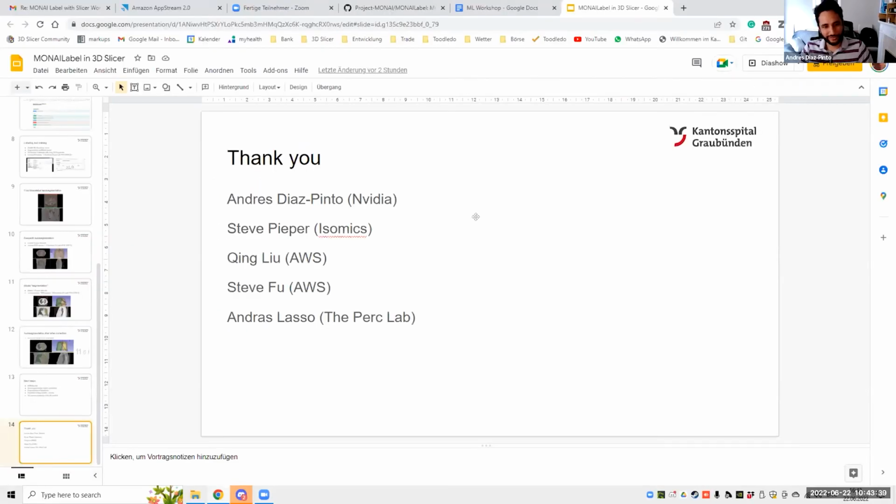Well, thank you very much, Dr. Rudolf. This is very nice. I don't know if there are questions for Dr. Rudolf or comments. I have a couple of things that I want to do. One is how to modify the MONAI Label module, and also go through the different buttons we have in Slicer, and also the frequently asked questions. But I just wanted to check with Steve or Michael. I think that sounds like a good plan, and people have been getting connected to their servers.